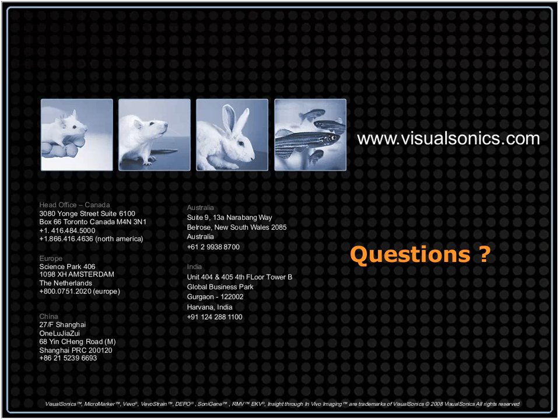Thanks, Mina. Those are great questions. The depth issue comes up all the time. I showed you imaging through the mouse brain where we can see right down to the bottom. Obviously, using a lower frequency helps with this, and removing the skull helps tremendously as well. So there are certain advantages, but the goal is always non-invasive procedures. And I think I've shown that at least in a mouse we can do that.